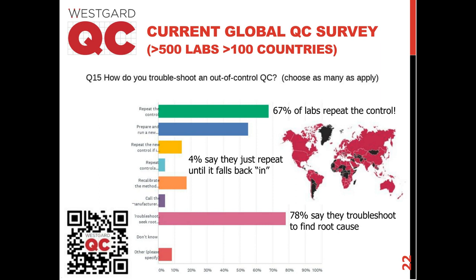It's great for your QC vendors, it's great for your diagnostic manufacturers, because you're burning more product up. You're burning more reagent, you're using more supplies, you're running more controls. That makes everybody but the laboratory more profitable. If you're looking for a low-hanging fruit on saving money, try to figure out how you could reduce the number of times that you're repeating controls and troubleshooting.